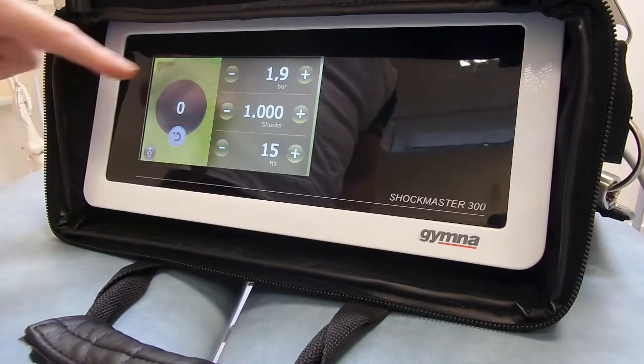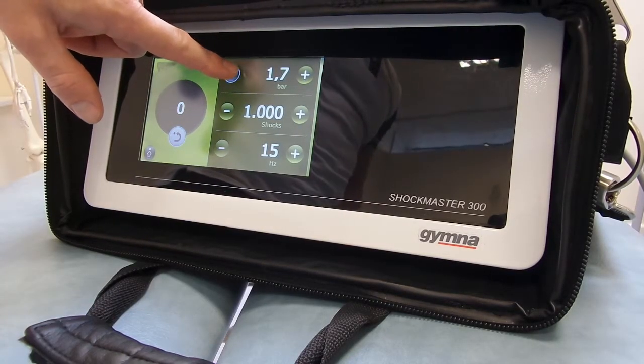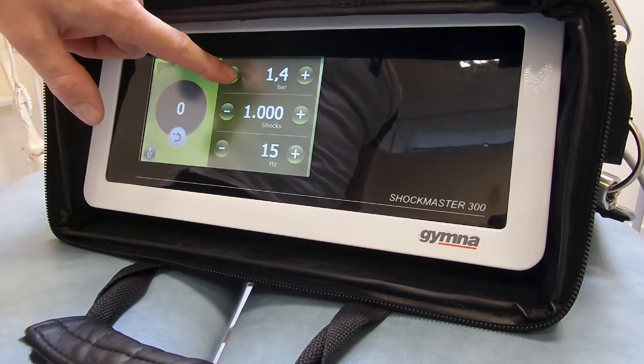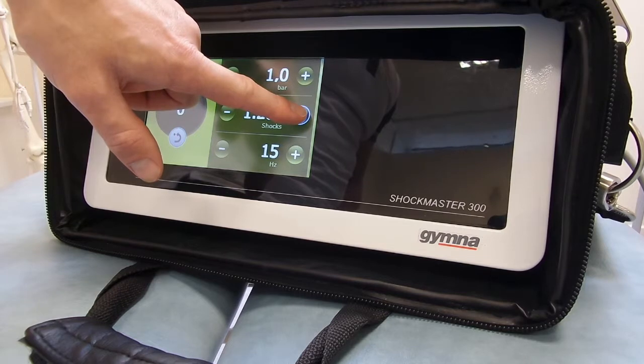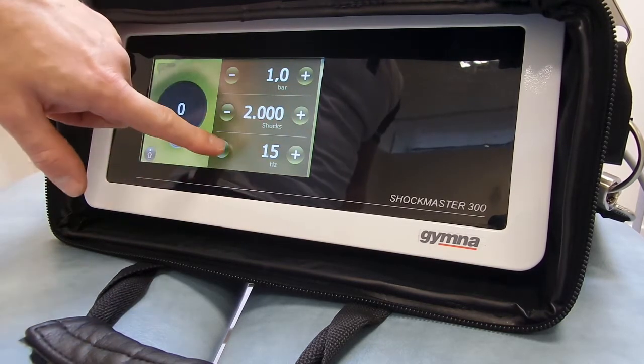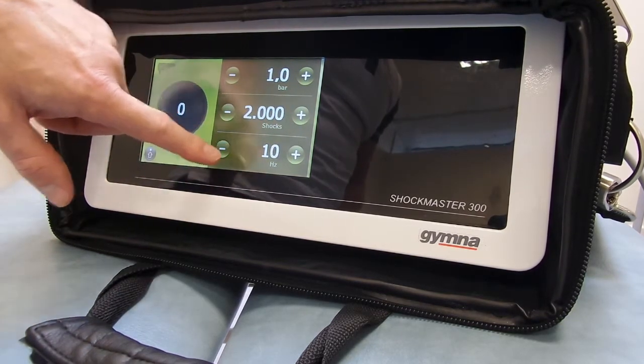The Gymna is an air compressed machine not a magnetic electron machine and so its settings are in bar. Going down to one bar which is the equivalent of 60 millijoules. Do 2,000 shocks again at 10 Hertz.